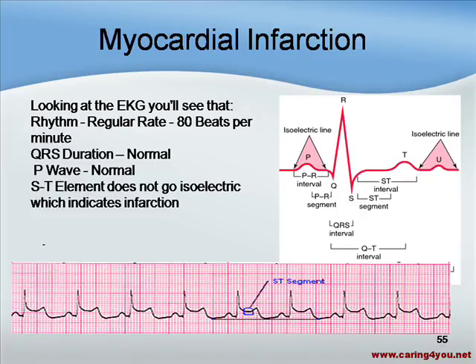Also, if you look at this strip, you can see the Q in the QRS complex is inverted lower than the S. There is no noticeable ST segment — it slides right from the QRS into the T wave. This is a sign of a myocardial infarction. The Q being lower than the S, combined with the missing ST segment, are the key signs of MI on an EKG strip.